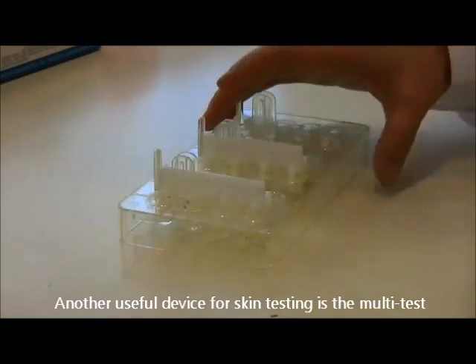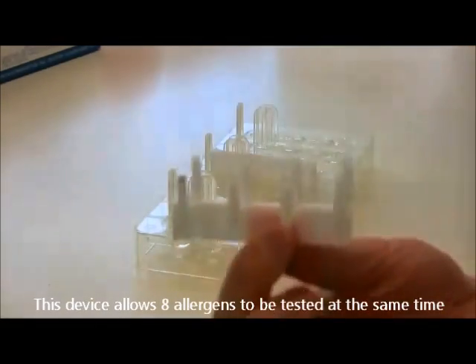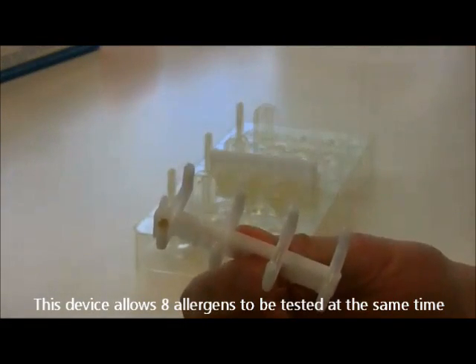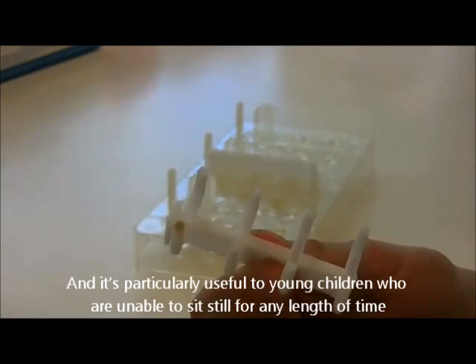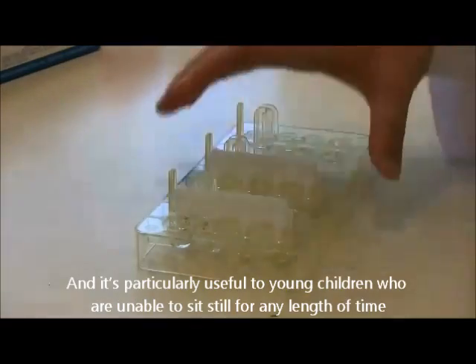Another useful device for skin testing is the multi-test. This device allows eight allergens to be tested at the same time, and is particularly useful for young children who are unable to sit still for any length of time.